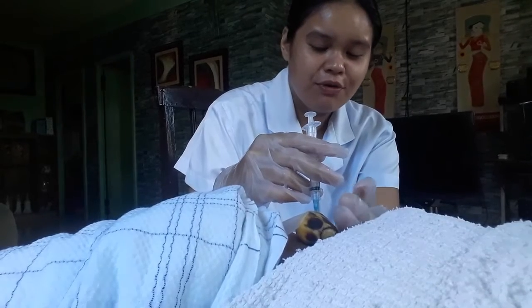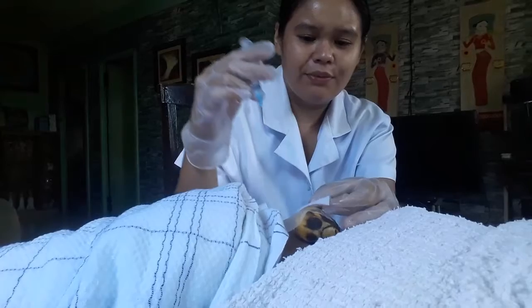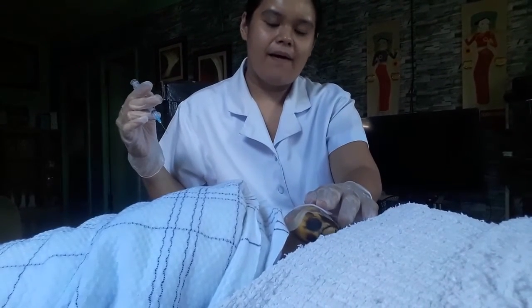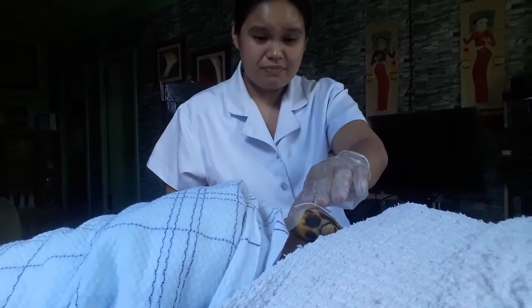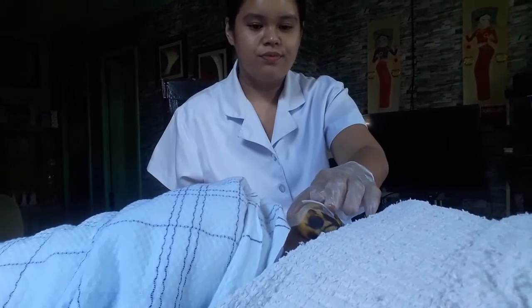After injecting the medication, remove the needle and place a gauze pad quickly over the site. Remember, do not massage the site so as not to damage the tissue.